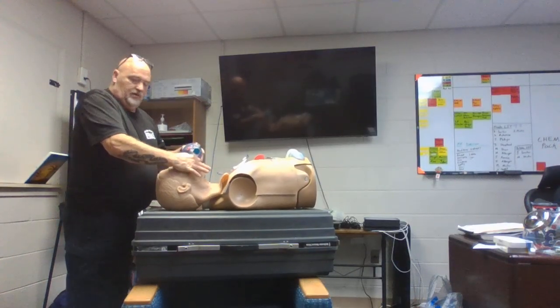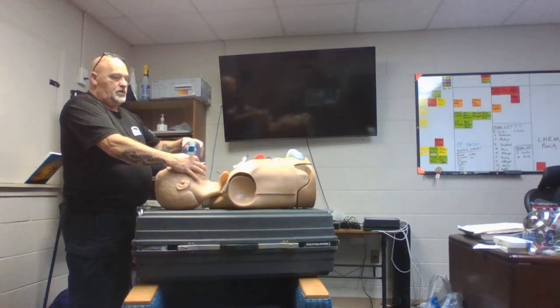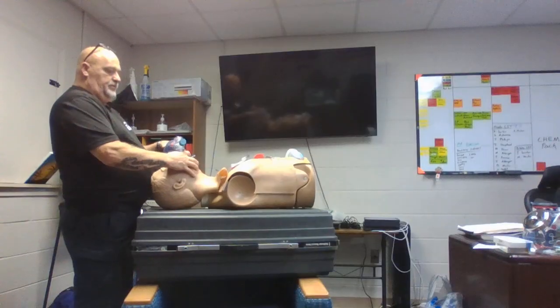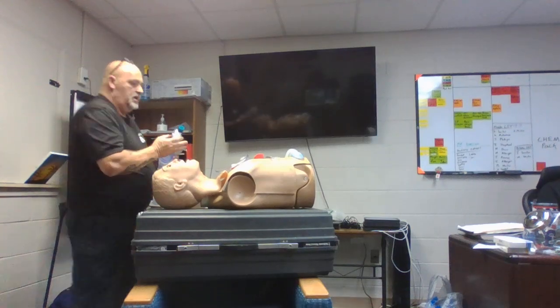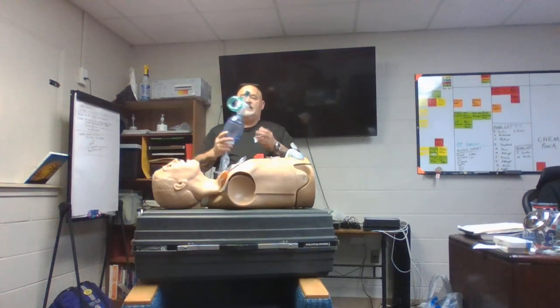You're pushing it down, right? This is the most common thing that we see. This, the CE, pull that airway open, right? Just enough to get the chest to rise and fall. We can use this all by itself. You're getting really good compliance, you're oxygenating, you're ventilating. This is fantastic. It's great, right?